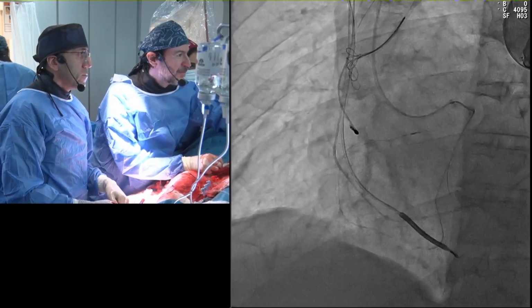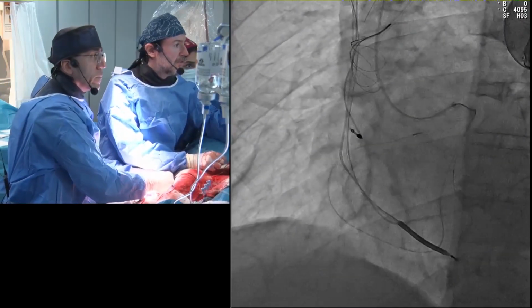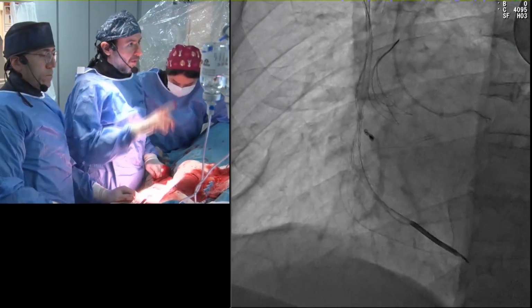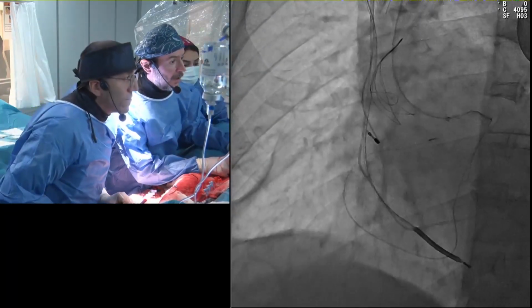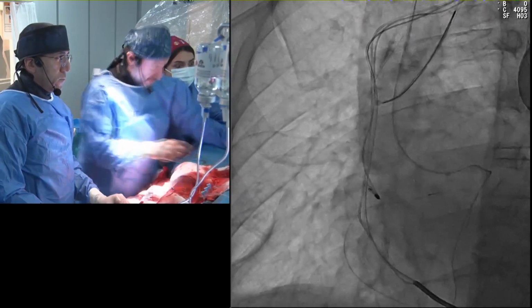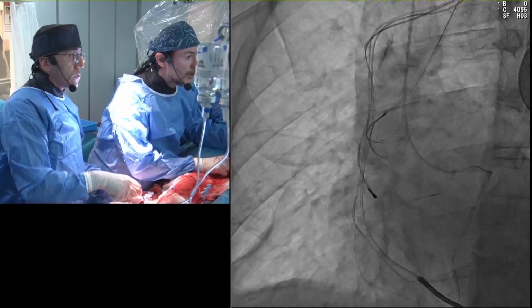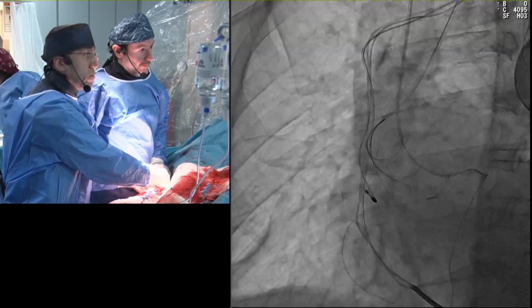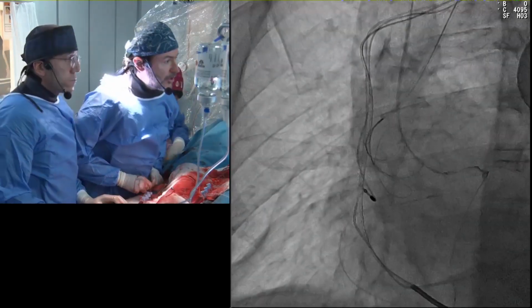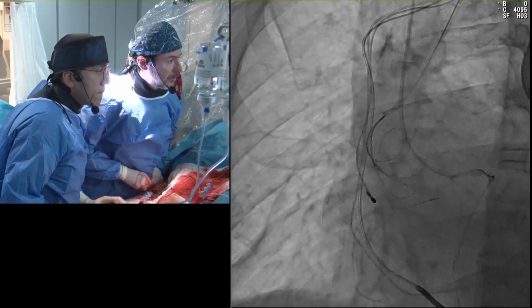One safety measure to be done at this point is, when we grab it and we snare, the left guides are really deep in the left main. So when you grab this, you're going to suck the guide in and you may have a dissection. One safety approach, we have a paper that's going to come about that technique: you bring a wire from your EBU guide or your XB guide, looking at the guide coming into the left main, a wire that floats into your left sinus from the donor guide. Whatever traction you do from the other side will prevent your guide from intubating at that same moment. So you protect the ostium whenever you're externalizing.